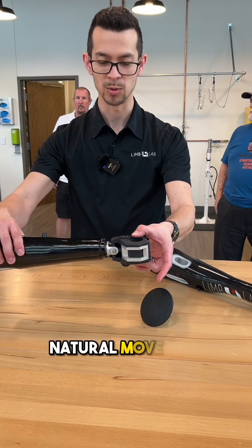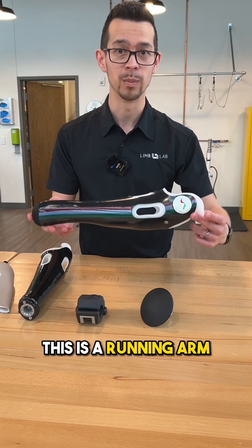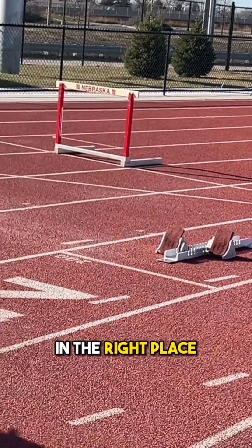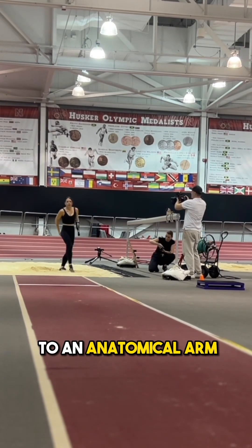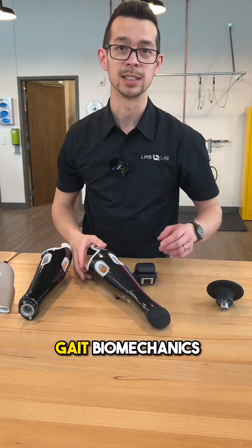That's going to allow for a more natural feel. The other device is very much activity specific — this is a running arm. The design allows Petra to come off the starting blocks with her arms in the right place. This blade shape is going to keep her aerodynamic and maintain weight similar to an anatomical arm, allowing for more natural balance and better gait biomechanics when running.